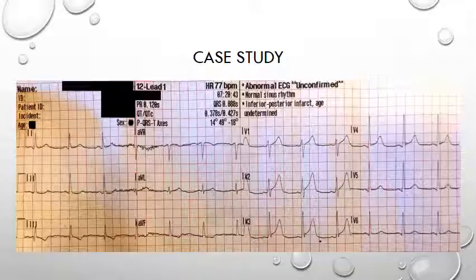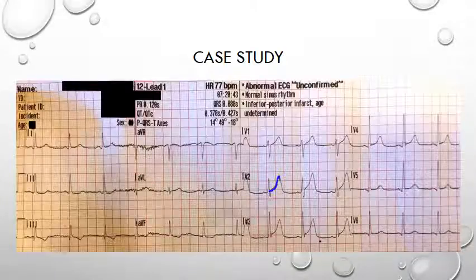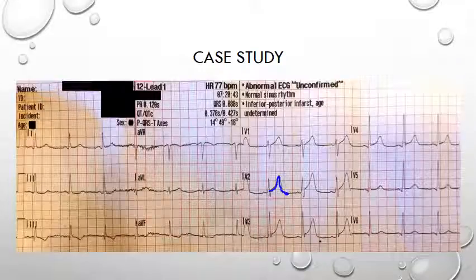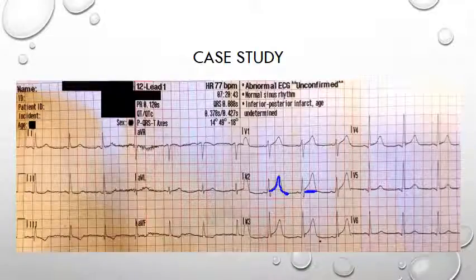Hyperacute T waves are broad and asymmetrically peaked, and they can be seen in the early stages of ST elevation and may often precede the appearance of ST elevation and Q wave formation. Here in V2 we can see a concave upsloping hyperacute T wave that's asymmetrical. We can differentiate these from a hyperkalaemia-type T wave because of the wide base. Prinzmetal angina is another condition in which hyperacute T waves may be seen.